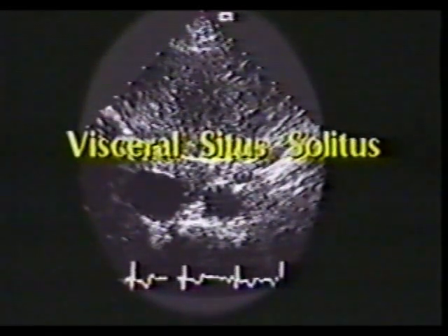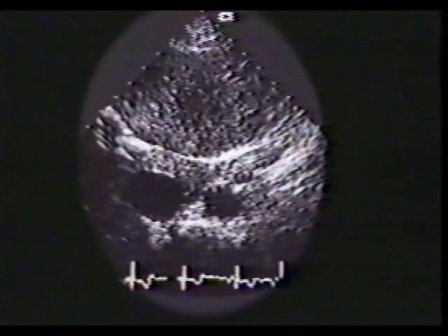A detailed ultrasonic evaluation of the viscera and great veins is essential for complete evaluation of complex lesions. It is best to start with the views of the upper abdomen and to identify the inferior vena cava and aorta utilizing the transverse as well as the longitudinal views. Note the normal side-by-side relationship of the aorta and inferior vena cava. The inferior vena cava is on the patient's right and the aorta to the patient's left.